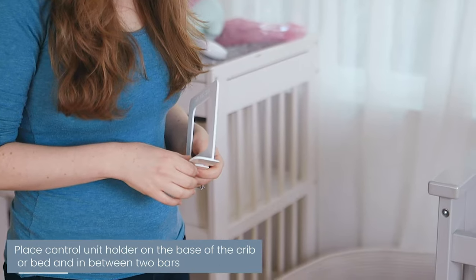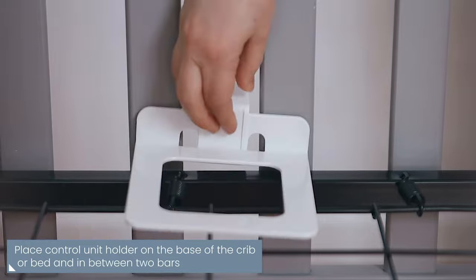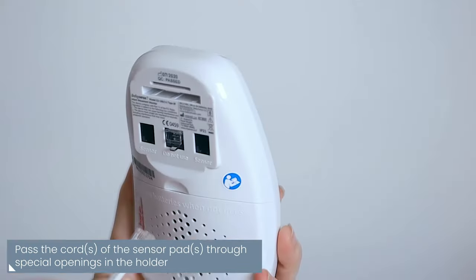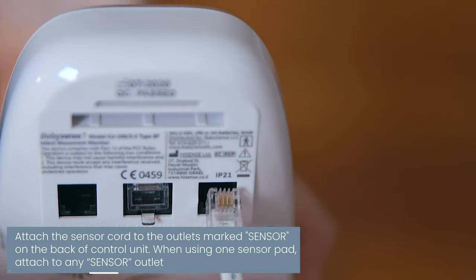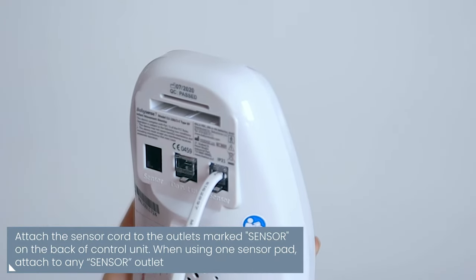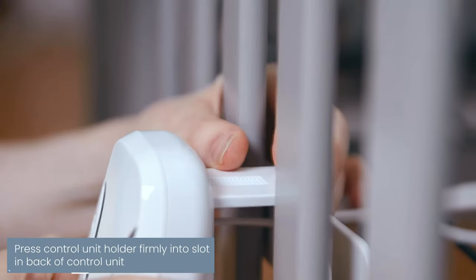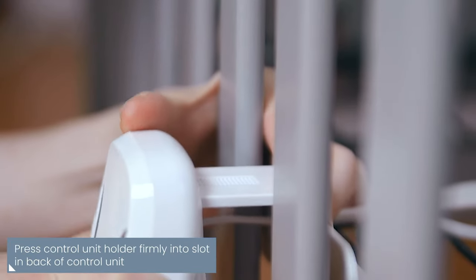Place the control unit holder on the base of the crib and in between two bars. Pass the cord of the sensor pad through the special openings in the holder. Attach the sensor cord to the outlet marked 'sensor' on the back of the control unit.